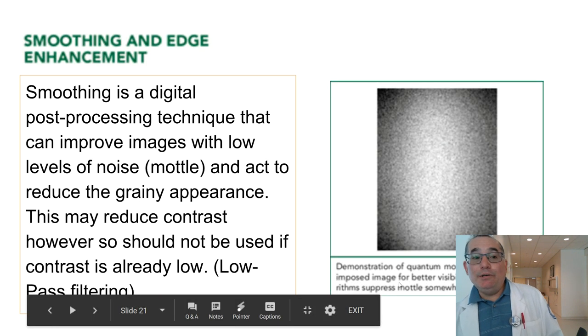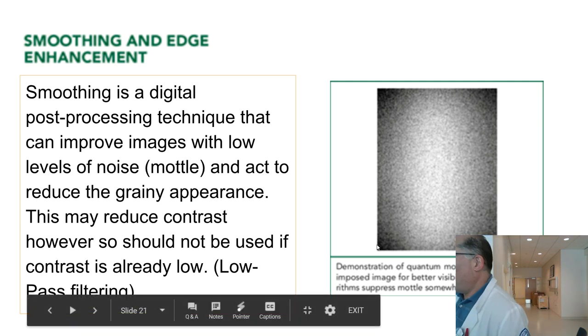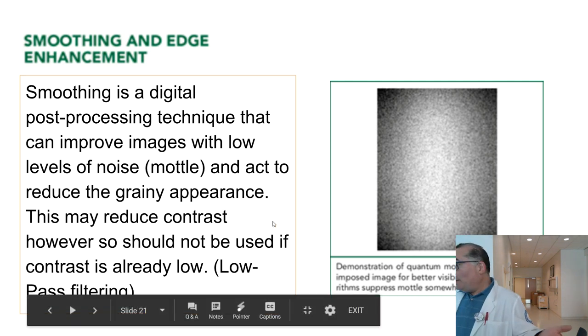But what would we do without windowing and leveling? Try to get the technique right the first time? Yeah. That's right. But even if you're a super tech, you just can't be super every time. You'll get cases where things are difficult and don't always work out as you'd like, even for the most seasoned technologists. And sometimes we're working with equipment, it doesn't always work perfectly.